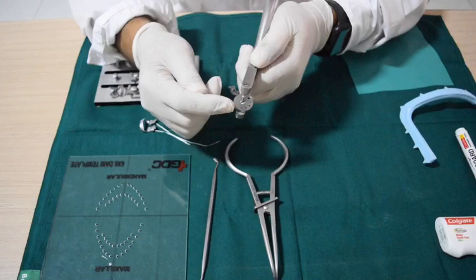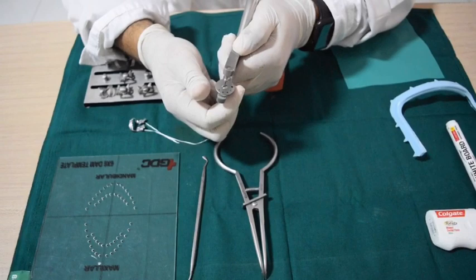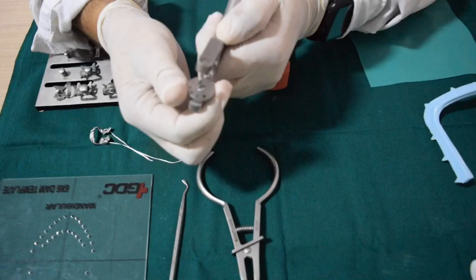The first hole is for mandibular anteriors. The second one is for maxillary anteriors. The third one is for maxillary and mandibular premolars. The fourth one is for mandibular molars. And the last one is for maxillary and mandibular molars.